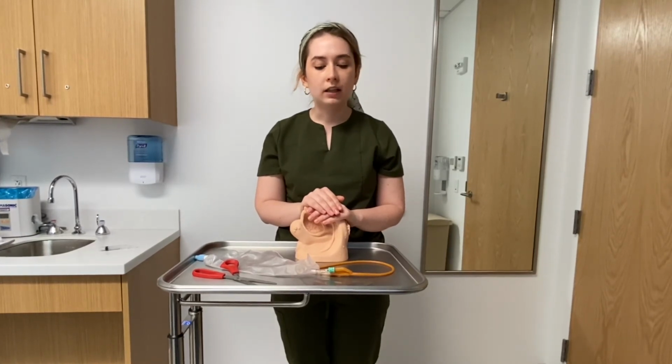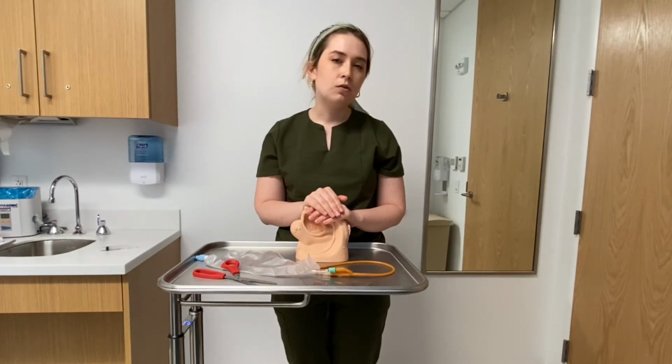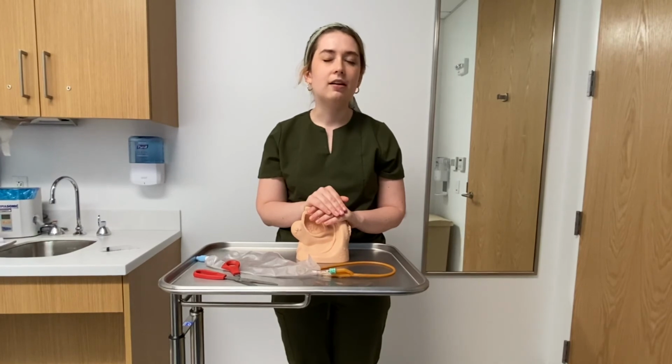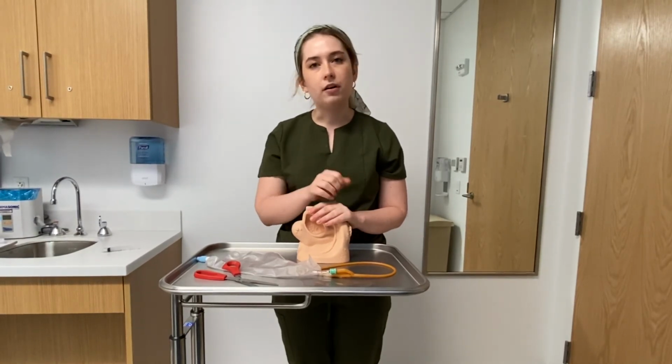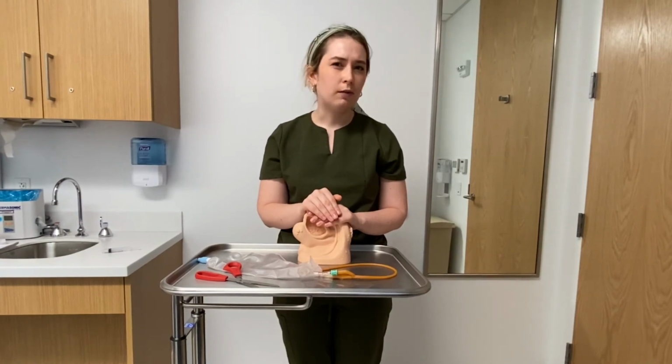You should not be feeling any significant pain from the catheter removal, but it is normal to have some burning with urination, some frequency, and some urgency after catheter removal due to irritation of the urinary tract. This usually resolves within a day or so.